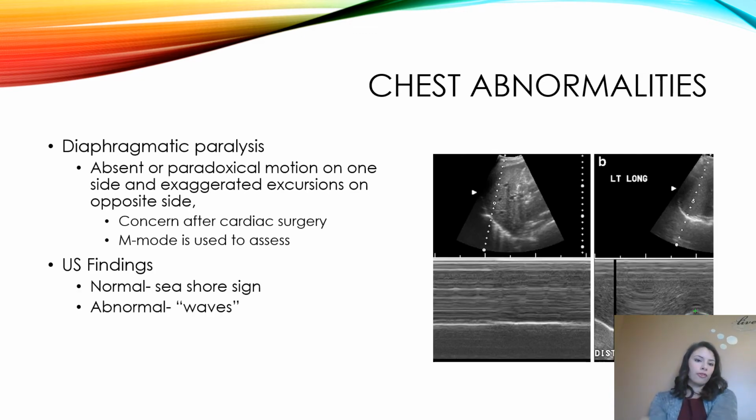Lastly is diaphragmatic paralysis, and this is the absence or paradoxical motion on one side and exaggerated excursions on the opposite side of the lungs. This can be a concern after cardiac surgery, and M mode is used to assess.